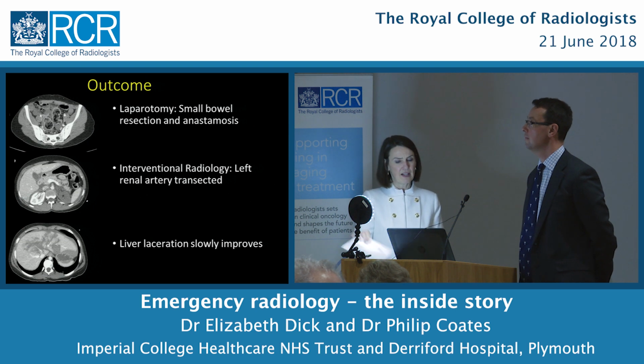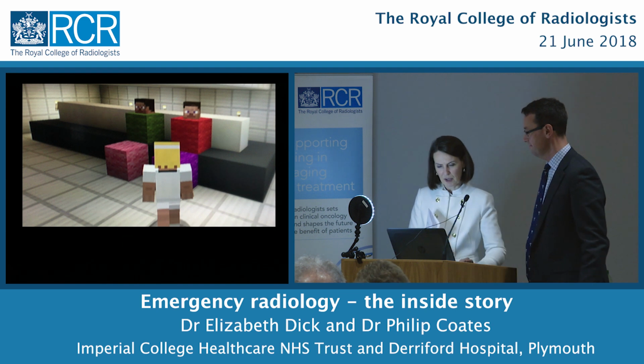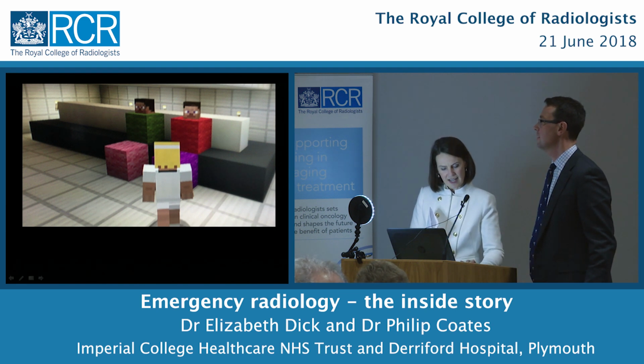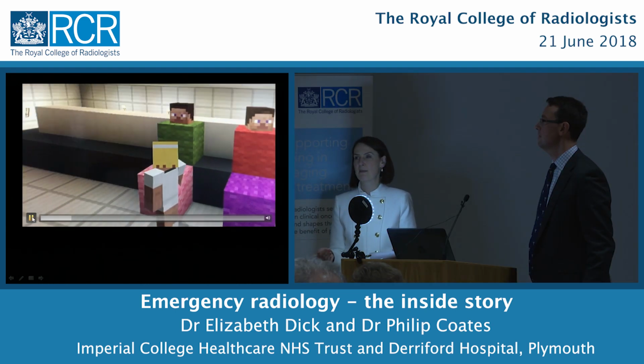Okay, Phil, I think there's another patient. Oh no, there's one more for me to see, isn't there, before I go back? Okay, so the next lady that we're going to look at is not a trauma patient. She's a lady who's come in with abdominal pain.